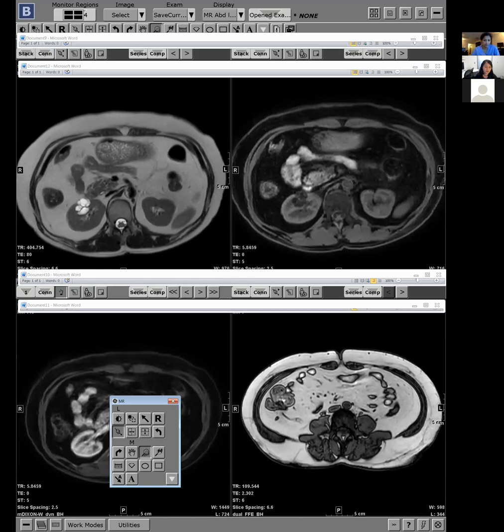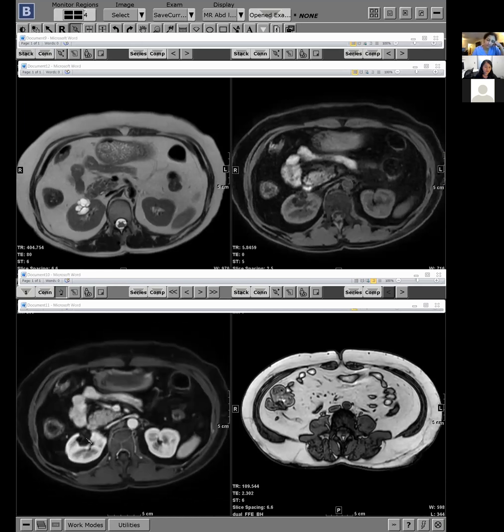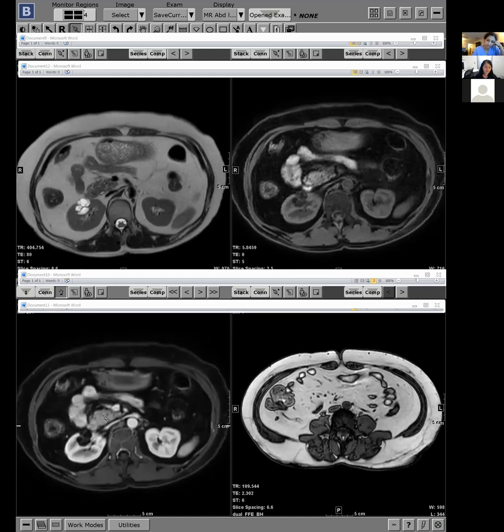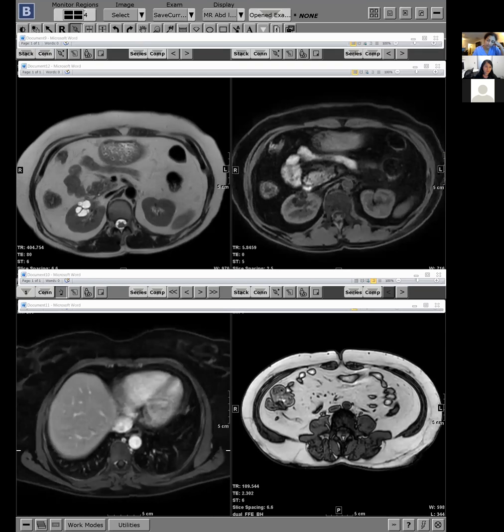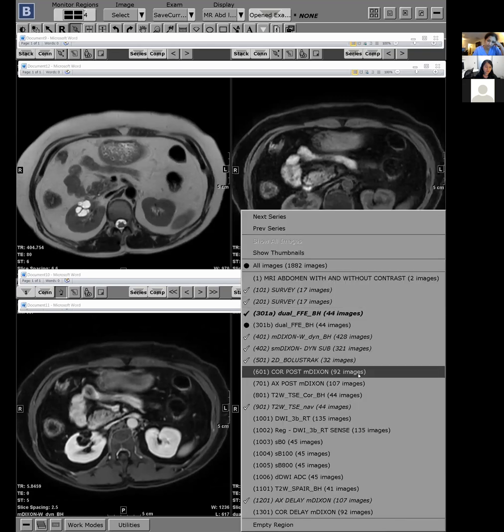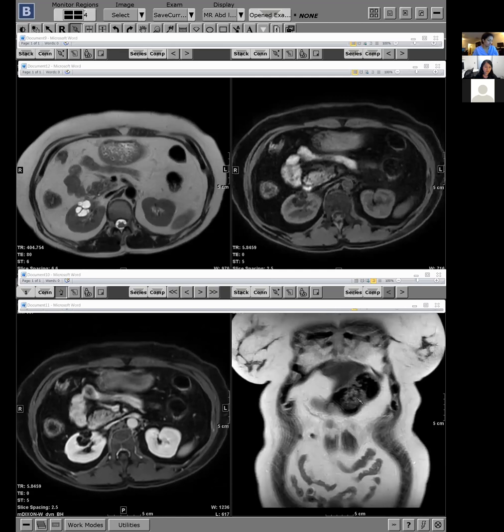So there's a new Bosniak classification, not tremendously enhancing. I looked it up. Based on the Bosniak classification, this lesion would probably be 2F, based on 2018 criteria. These patients usually get followed up. But this is an older case, from 2017, so before we had the updated criteria.